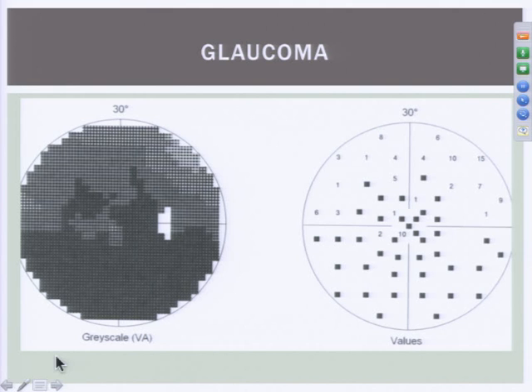In glaucoma, we have field loss that's a little bit less regular. It's pretty easy in a stroke because it's a straight line loss, right versus left. But in glaucoma, we often have people who have sort of diffuse vision loss. But if we can identify in the visual field that this patient, and this was their only eye, the other eye was actually blind, we can see that this person has much better vision above center and virtually no vision below center.